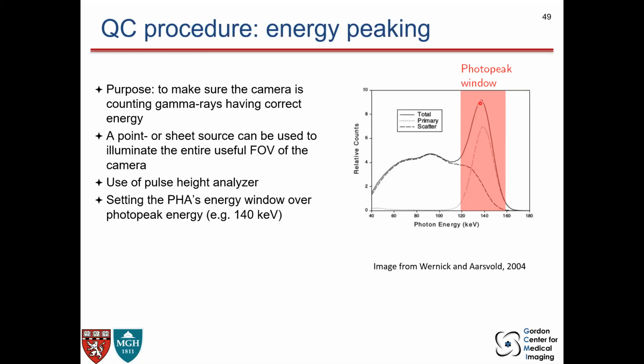That means your photo peak is shifted. So if you have a bad energy spectra, that's shouting for proper calibration.